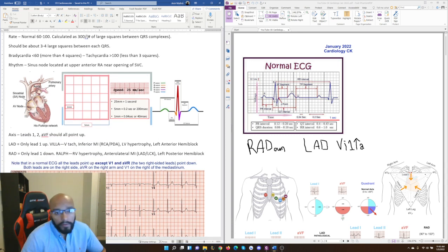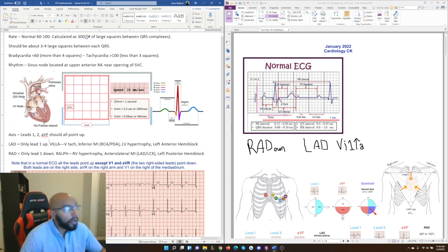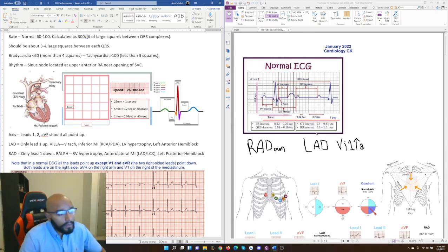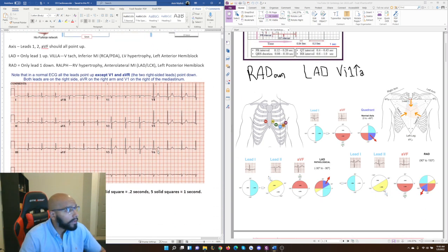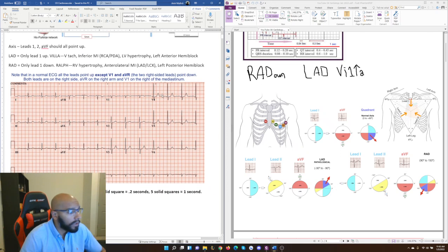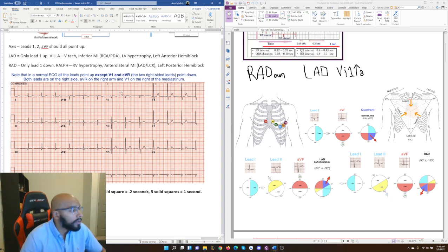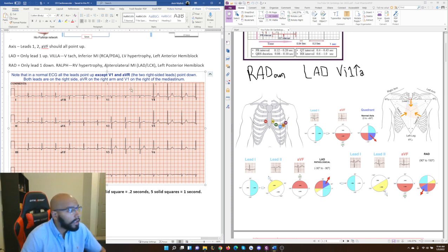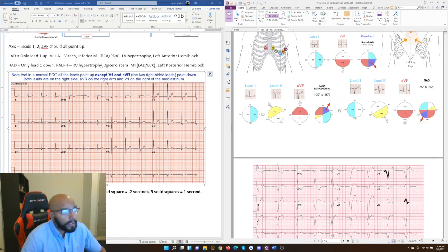The first topic discussed in First Aid CK is axis deviation. They use the mnemonics RAD-RALPH and LAD-VILLA to cover things that can cause axis deviation on the ECG. Axis deviation is something almost no Step 1 student tends to know well. To understand it, you have to look at different leads. Let's really understand what's happening in the various leads and what we're expected to see.